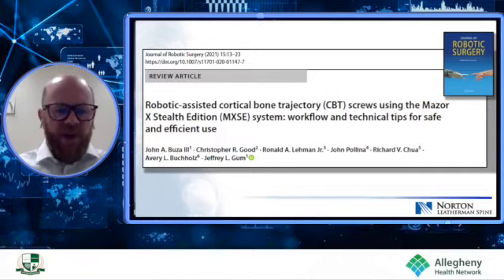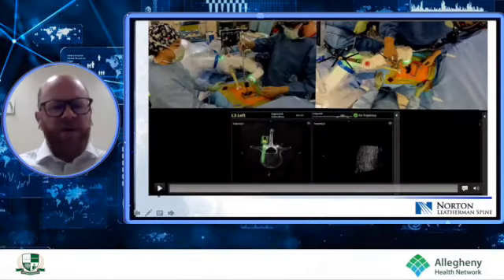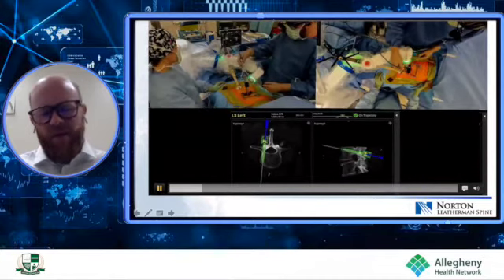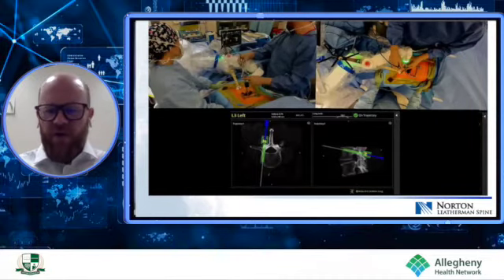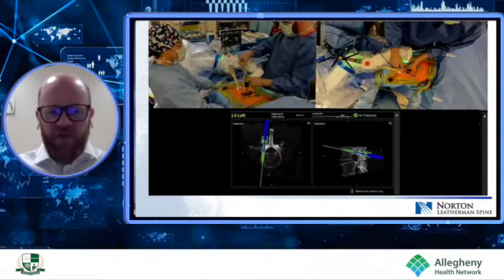Here's a quick video. Now, we've gone to a two-step workflow. So we cannulate with a high-speed drill, and then we go straight to screw. We don't even tap. Even in a cortical trajectory where everybody argues about tap line to line, tap one below, we don't even tap anymore. So we use the high speed drill. We cannulate that cortical screw pathway via the pedicle, and then we go straight to screw, which I don't show for time's sake, but you can see here that blue is our live image. That's our high speed drill. That's a navigation array on it. And that went right down our planned trajectory.